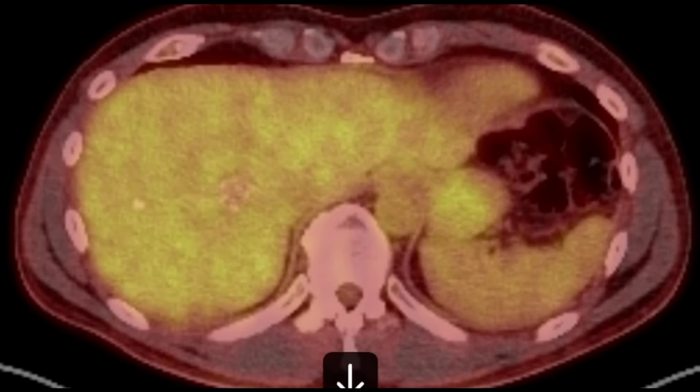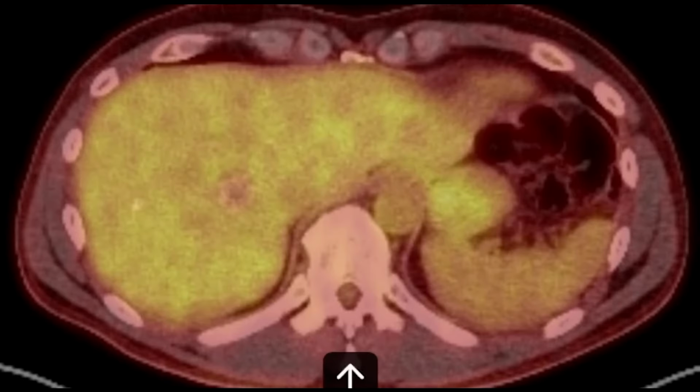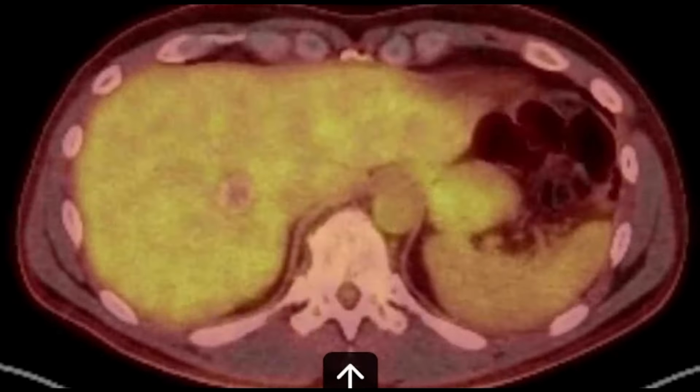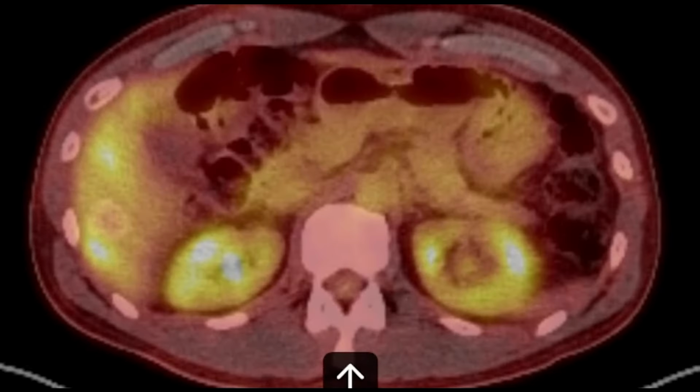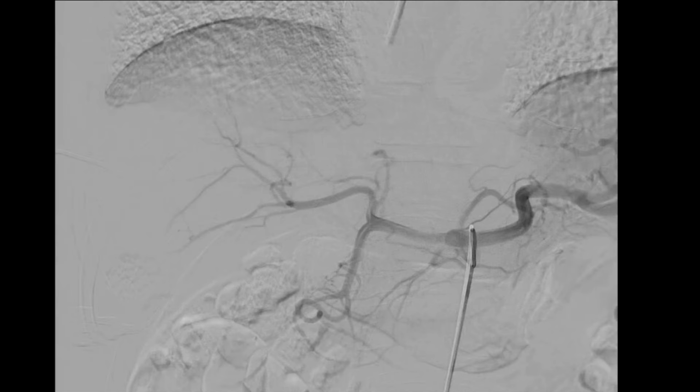This is a patient with colon cancer and liver metastasis who was doing well on chemotherapy, but recently had a PET scan which demonstrated 2 new PET-positive lesions in the segments 5 and 6 of the liver. He developed these lesions despite being on chemotherapy. And this is when you go do the mapping.